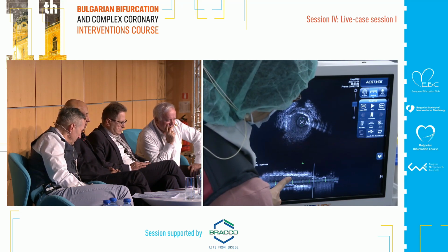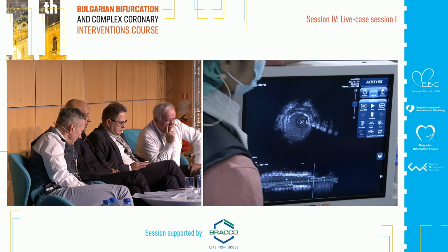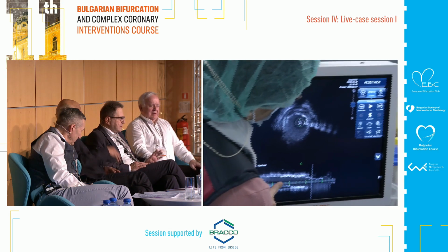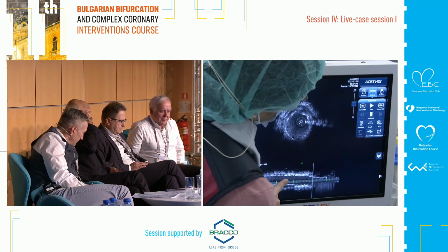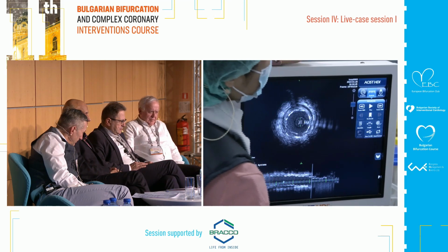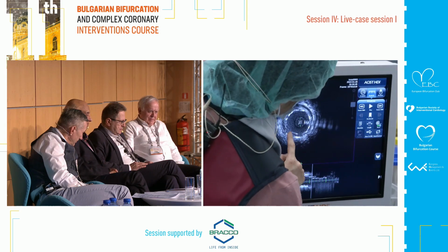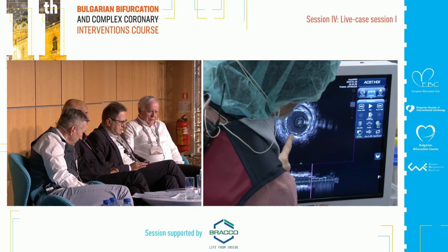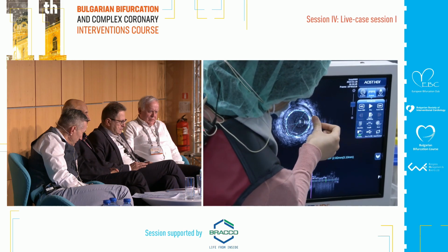That's not covered up. How much is it? Half a millimeter? Yeah. I think it's okay, but I hope you have it less than 2 millimeters. Because the original lesion was really here. I think that the original lesion is covered. What we do not cover is the roof of the ostium, because the artery is going downward.